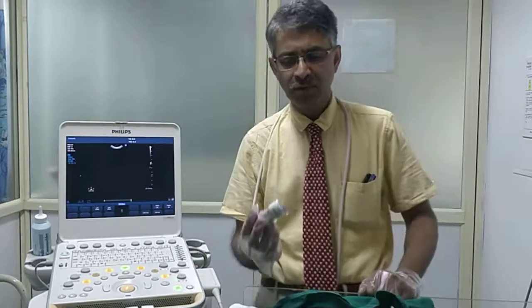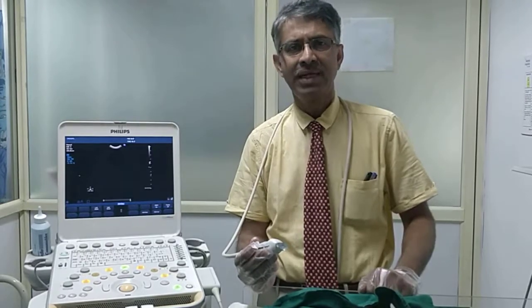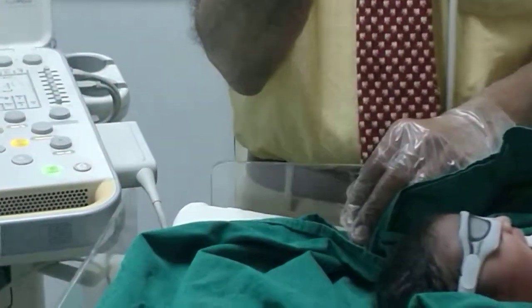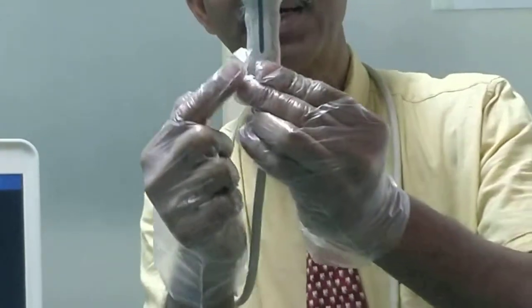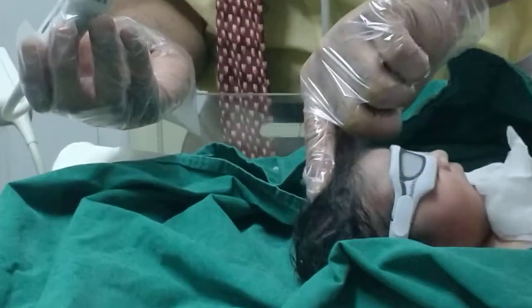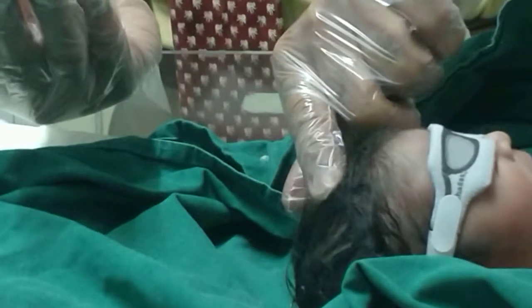In this brief introduction, I am going to show you how to perform ultrasound cranium in a neonate. The probe used is a high frequency probe. This is the C5 and C8 curvilinear probe. You can see the marker here, which should be facing to the right. This is the anterior fontanel, which is the window of opportunity to look at the brain. Being neonatologists, we are gifted because we can visualize the brain using ultrasound through this fontanel.